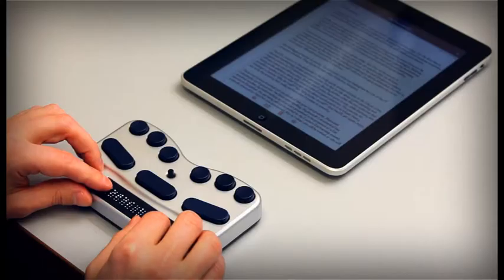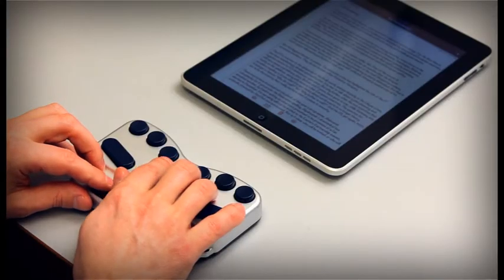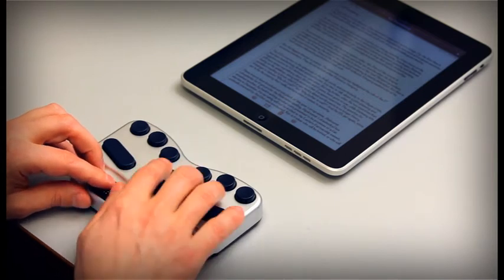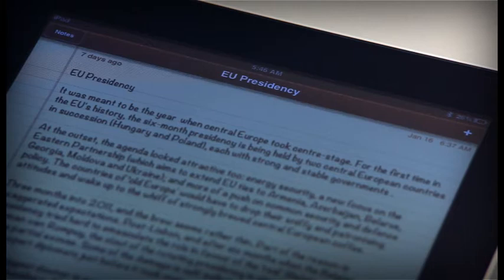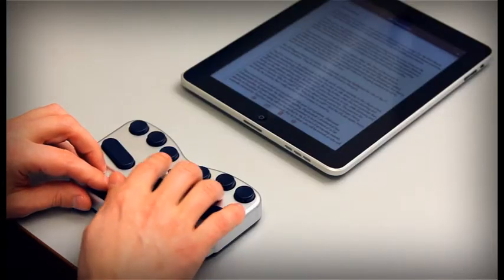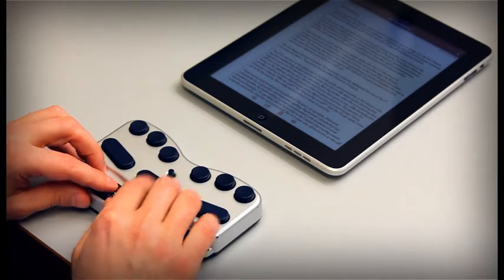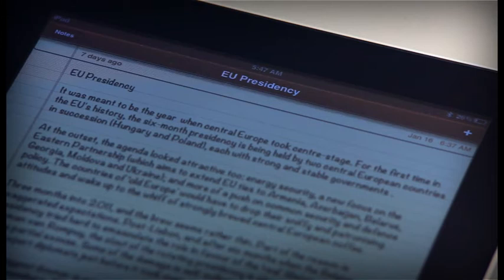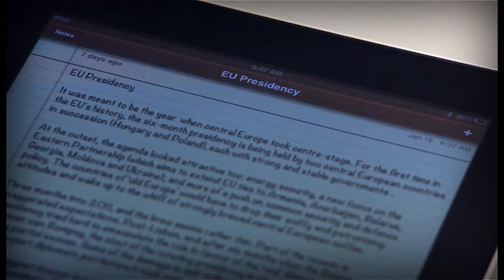At the top of most app screens, you'll find some action buttons and a title. The Notes button is the first, so you use joystick right to move to the next one, the title of the note, and the third one, the Add button. After the Add button, press joystick right to move into the body of the note. The first thing you come across is the day and time the note was last saved. With the next press, you reach the text of the note, and VoiceOver begins reading the entire note automatically.